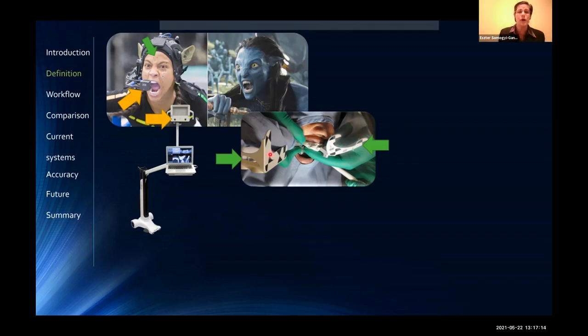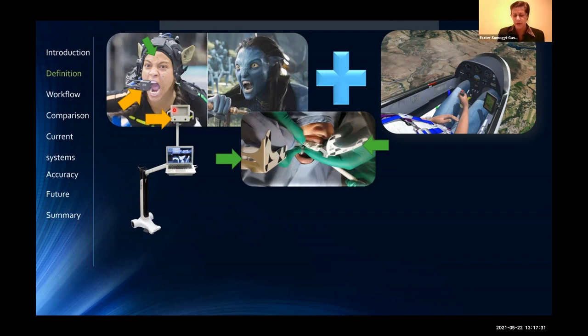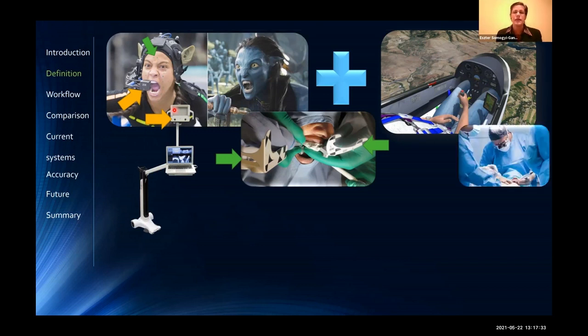And you're going to have a marker on the surgical drill or any kind of instrument to make sure that the camera in the system is going to see these and can correlate them in 3D. Plus, of course, we are not in robotics yet, so we also need an operator, and the operator is the surgeon in this case.